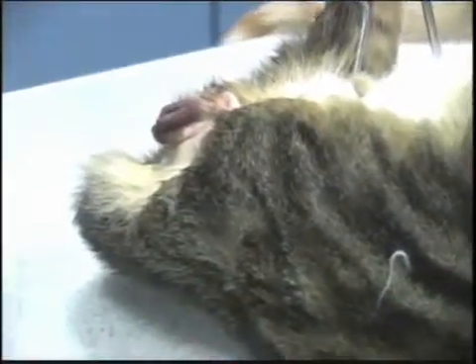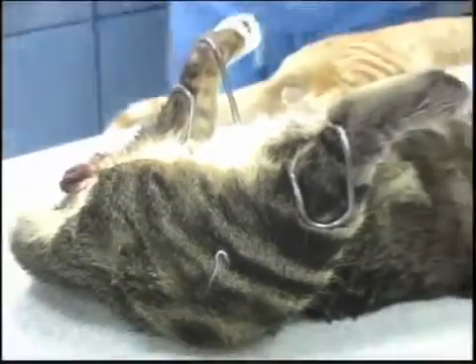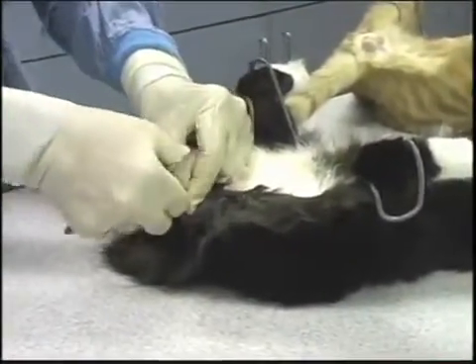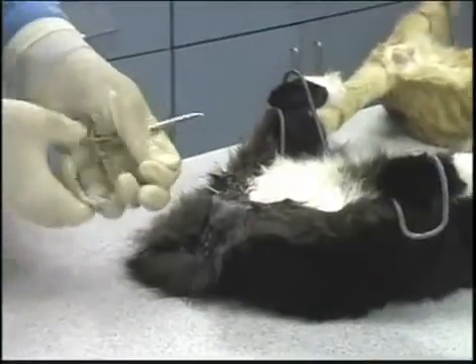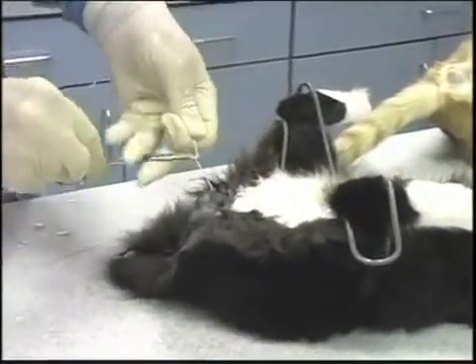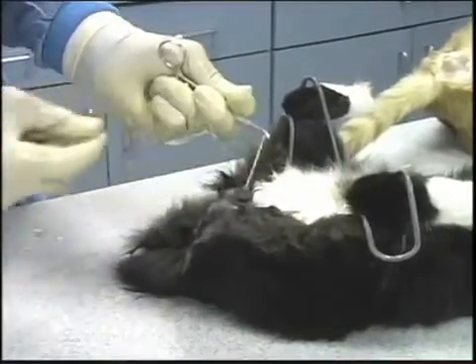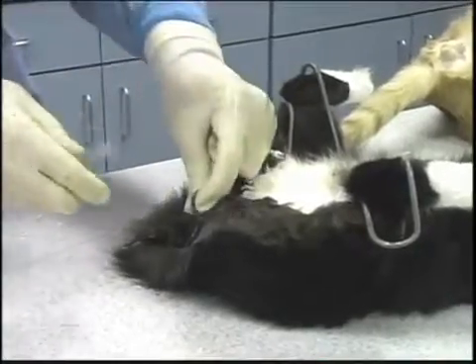So either one — if you like one technique you use it, if you like the other one you go with the open castration. This is a medium aged kitty, not a prepubescent one, and not over a year certainly. These are the ones I just typically do with an instrument tie: create an overhand knot in the cord and then cinch it down.